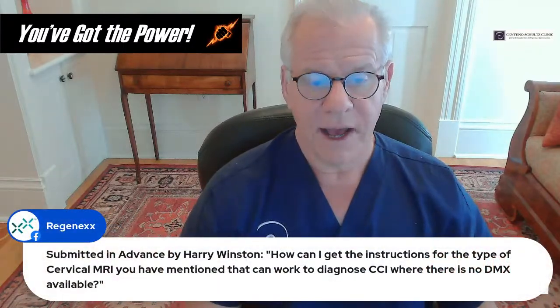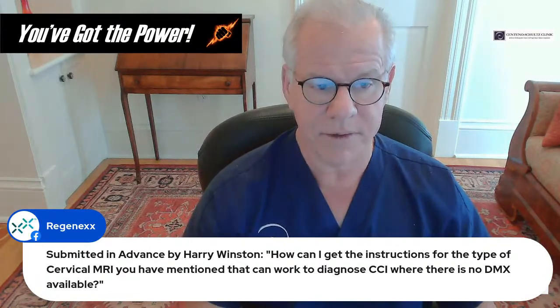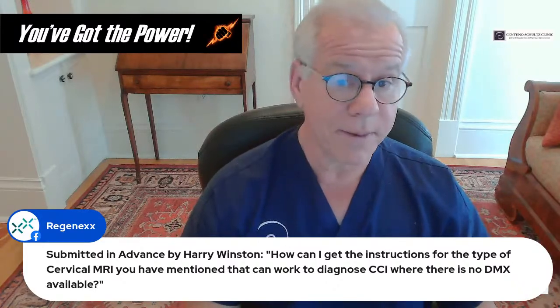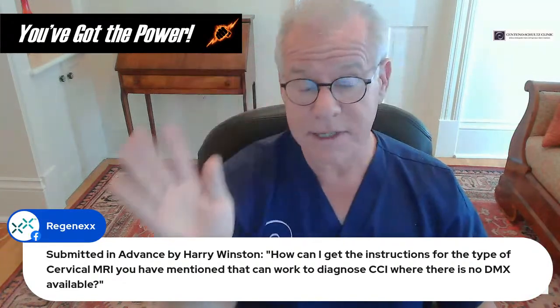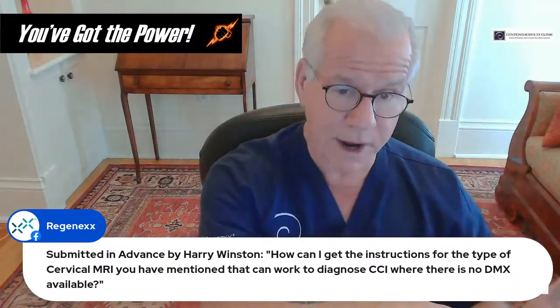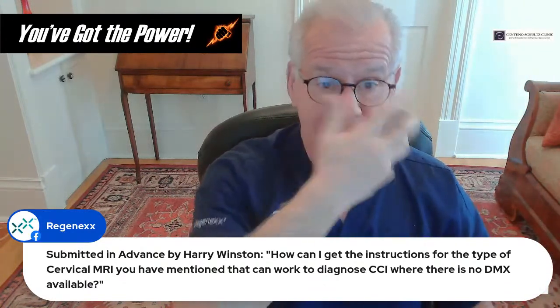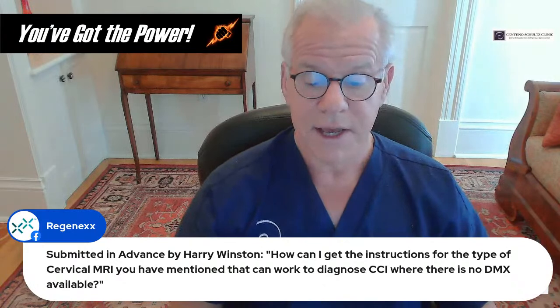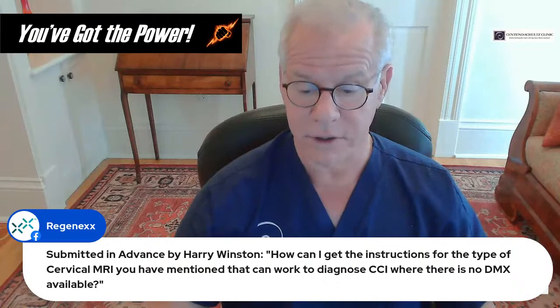How can I get the instructions for the type of cervical MRI you've mentioned that can work to diagnose CCI when there is no DMX available? Yeah, so that's a functional MRI. So it's an upright MRI. The big things there are making sure you get maximum flexion and maximum extension. That's on the MRI side. Now, if there is no DMX available, we also would recommend an open mouth lateral bending X-ray, right and left. So Carla has those instructions. If you just reach out to her, my assistant, she can get those to you.